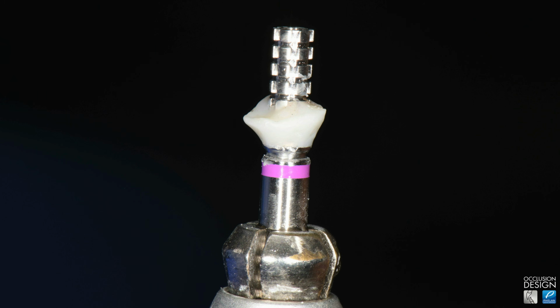Here's the custom healing abutment before I cut the top of the stock abutment off of it. And then we let that heal and we go to our 2-day rehabilitation prep process. For me, I get a wax up done.